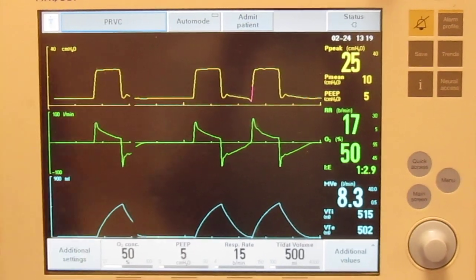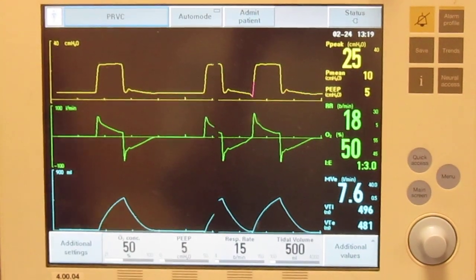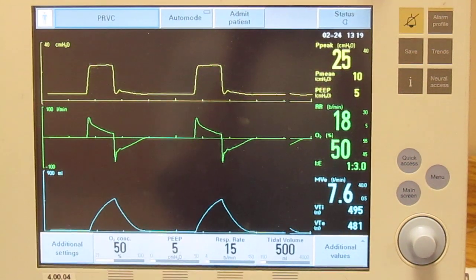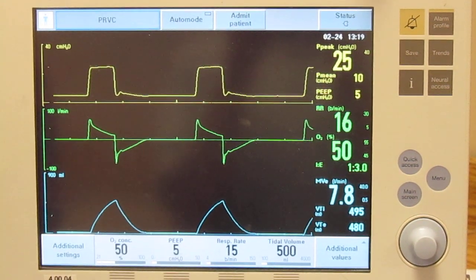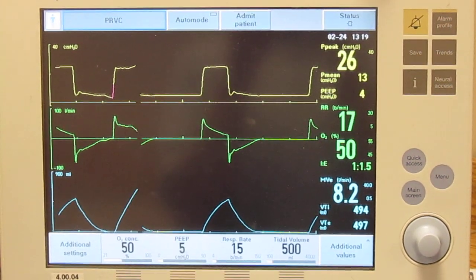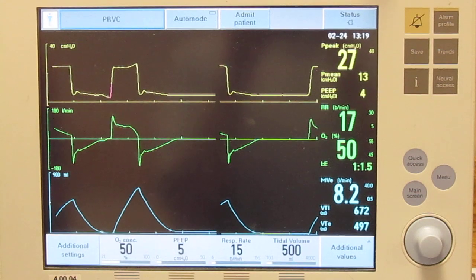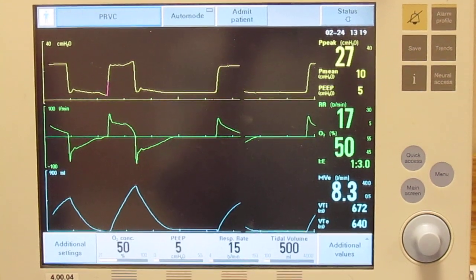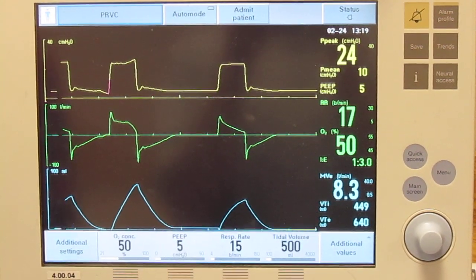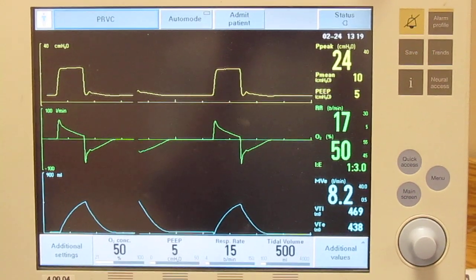The patient can also make bigger efforts if they want to — we should be able to see that down here. I'm going to make a very big effort. You can see that the volume went up a little, and the next breath should be a little bit smaller. And that's pretty much it for patient triggering.